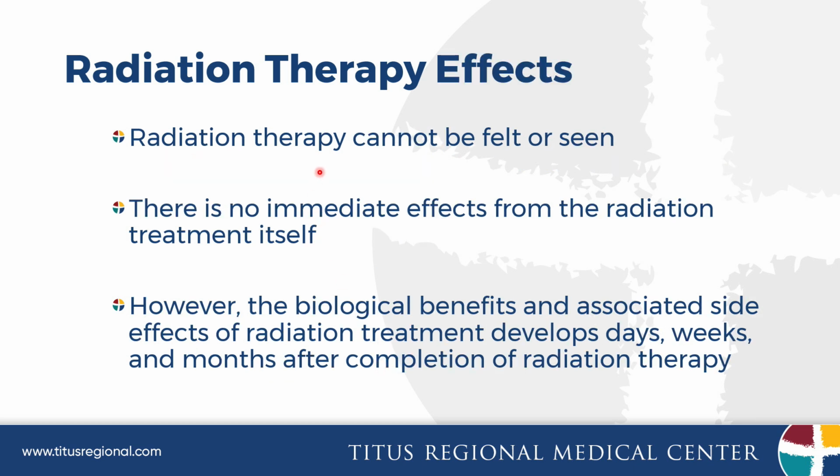When we deliver radiation therapy, it cannot be felt or seen, and most patients do not have any immediate effects from the radiation itself. However, the biological effects and the side effects associated with radiation therapy can develop in the days, weeks, and months after the completion of radiation therapy.